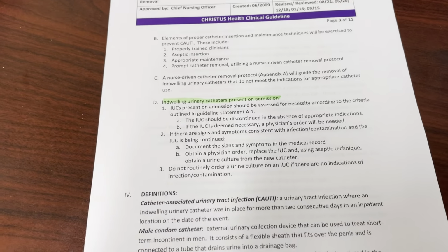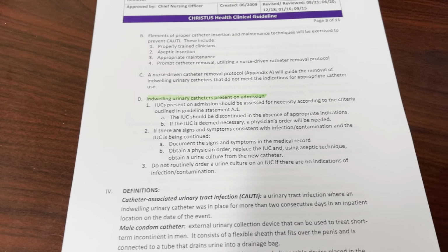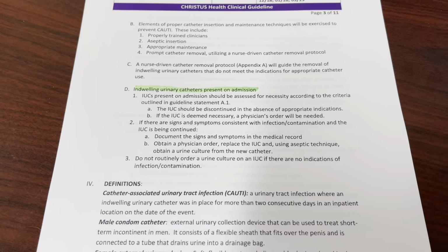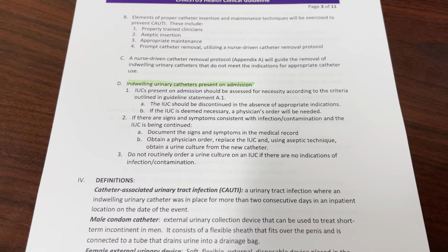If we have patients who come in that have a catheter present on admission, whether it's a chronic catheter or a catheter that was placed maybe in a different location and the patient came to us, we want to assess why they have that catheter in place. So did they need to continue having the catheter? If not, let's go ahead and get it out.